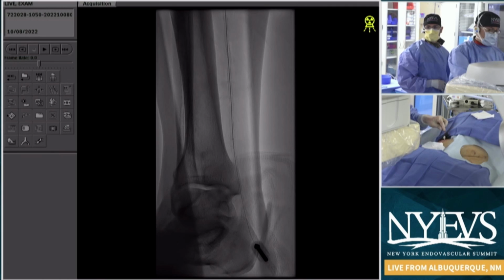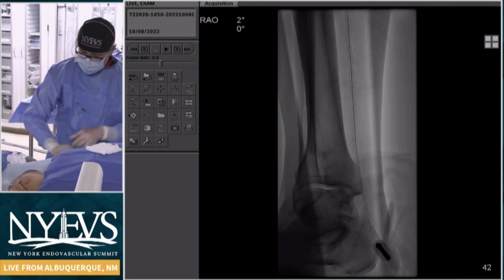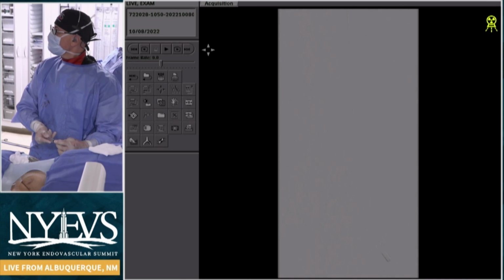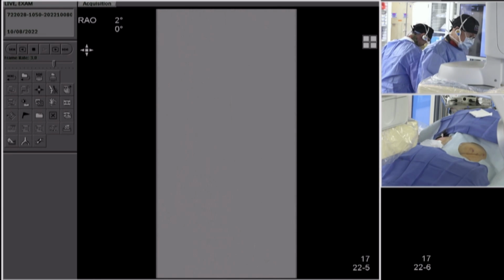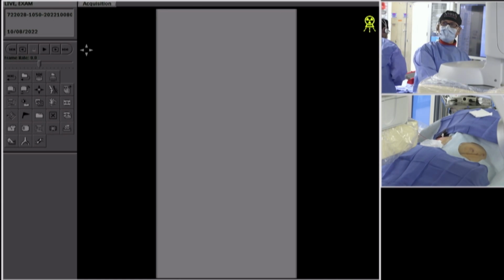So we just finished our 3-minute inflations along the length of the AT, and we were just about to take a follow-up angiogram here to see what we've got. So judging by that, I suspect that was nitro. Okay. That was a terrifying moment for me for live TV. There's a good saline injection. It was nitro, actually. Oh, nitro? Okay. Well, now hopefully it'll look even prettier.